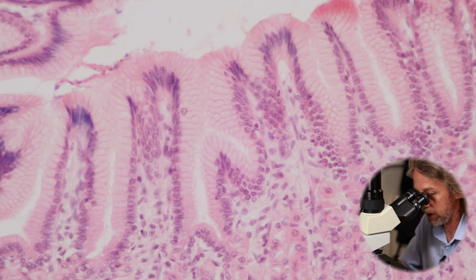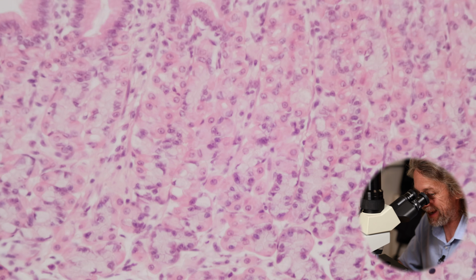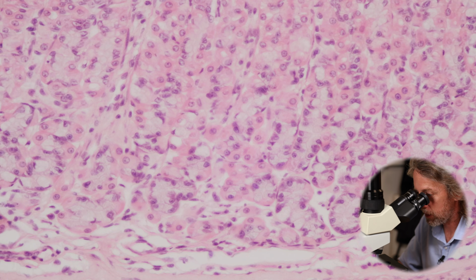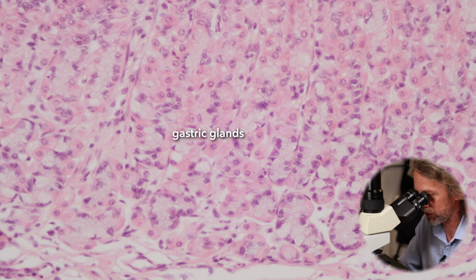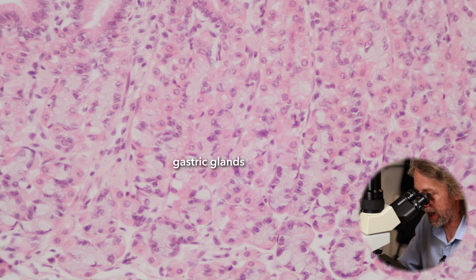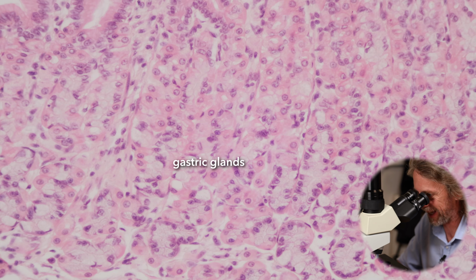Oh look, there's a bit of a double one there. And down here, these cells, we would call these the gastric glands. We've got lots of cells in there producing the things that are going to help with digestion. We'll get to that in a minute.